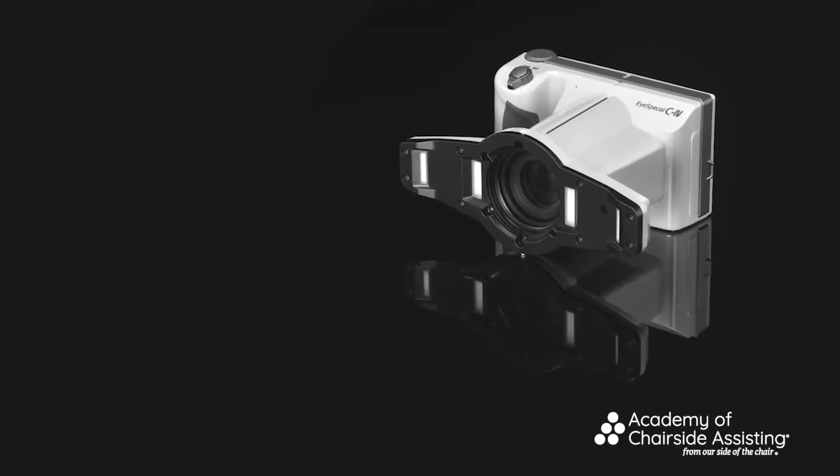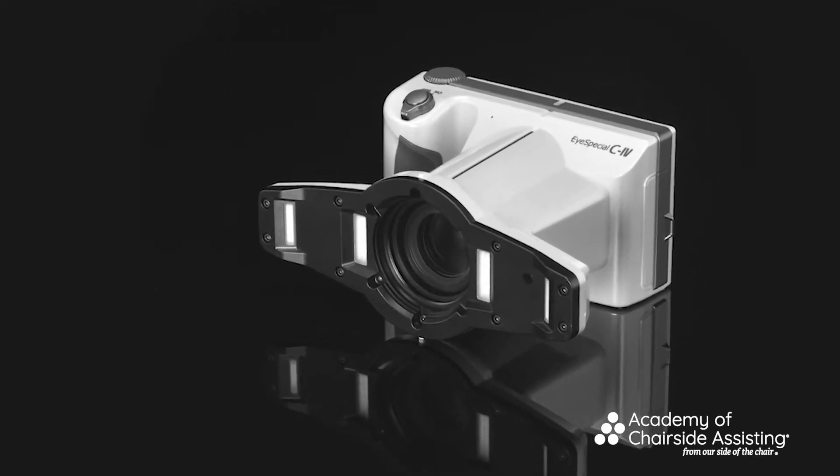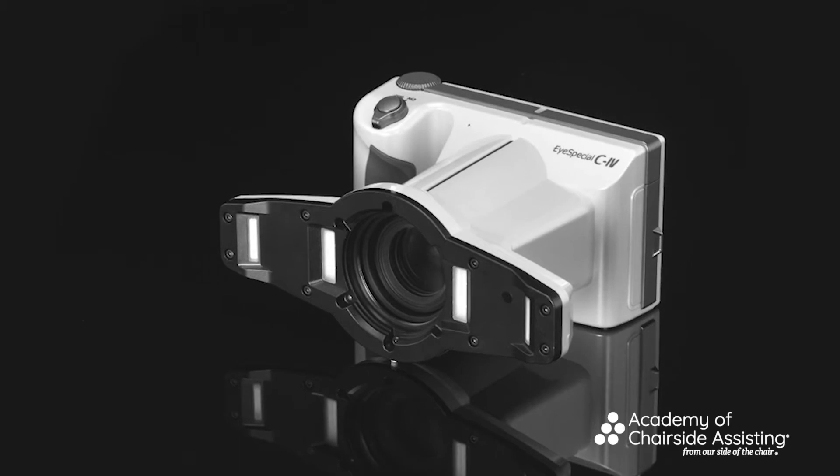The first camera we're going to go through today is our point-and-shoot camera by a company called Shofu. Shofu developed several different types and this one is the newest — the EyeSpecial C-IV. I'm going to show you how different it is compared to the DSLR camera and SLR camera we'll also be utilizing.